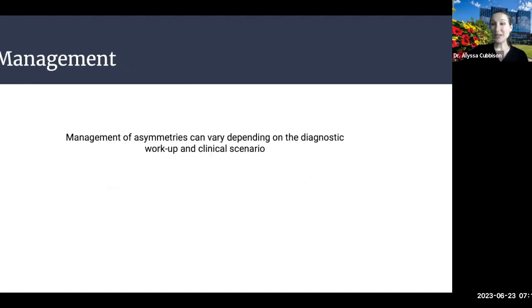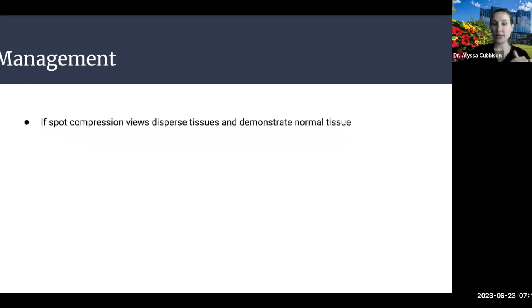So how do we manage asymmetries? It can vary depending upon the clinical scenario. So I will break down a few of the clinical scenarios and what BI-RADS we will assign them, and then how we typically manage them.